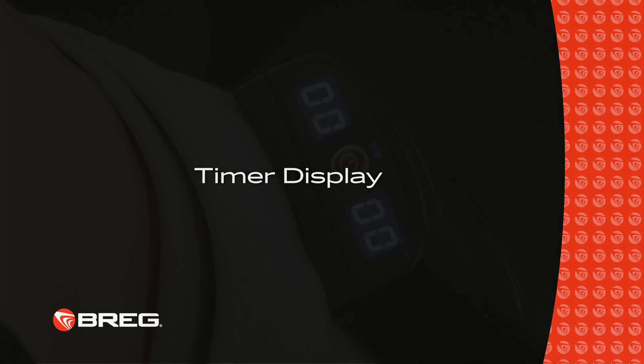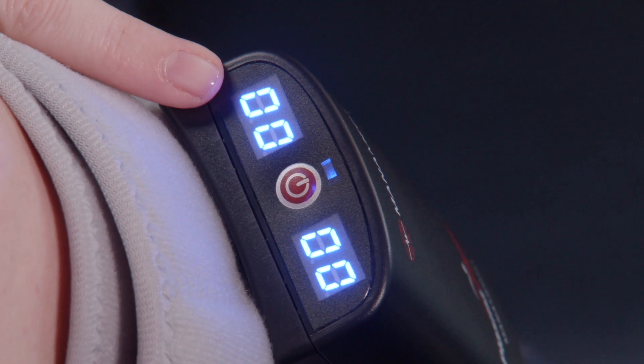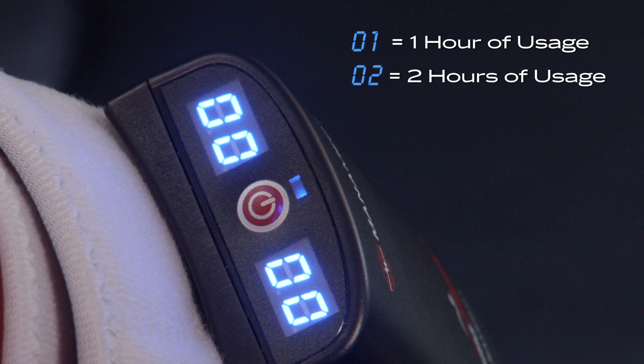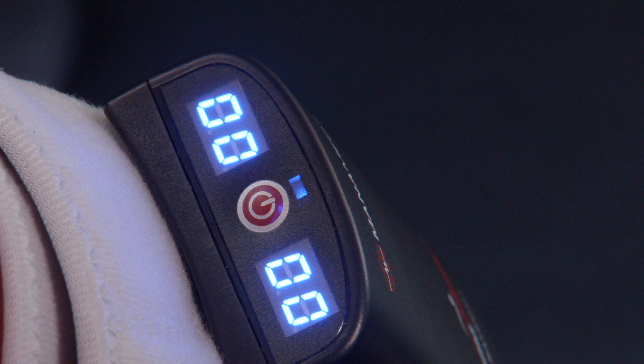When the PlasmaFlow is in use, the display on the left side of the power button operates as a timer. The screen will display digit 1 for 1 hour of usage, digit 2 once the unit has been used for 2 hours, and so on. When the timer reaches 99, it will automatically restart the count from 0.